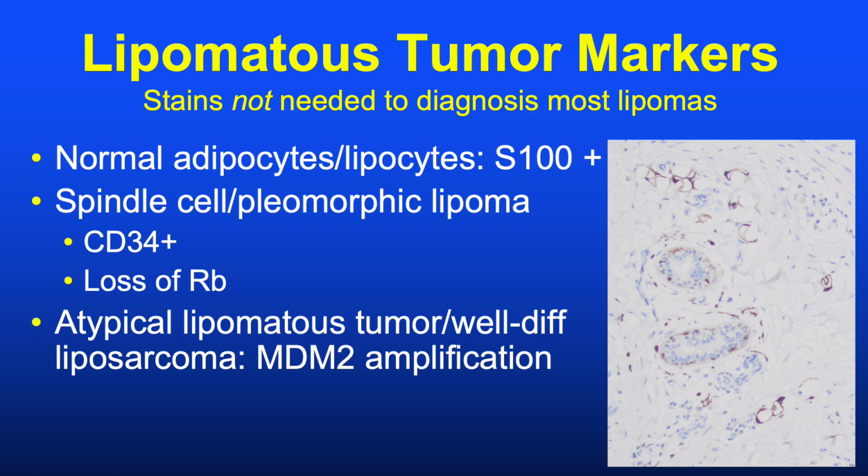Here I'm looking at the deep dermis where we have eccrine glands that have some scattered positive cells, but what we have are just periappendigeal adipocytes, but you can see them nicely highlighted and forming their typical signet ring appearance on S100 protein stain.